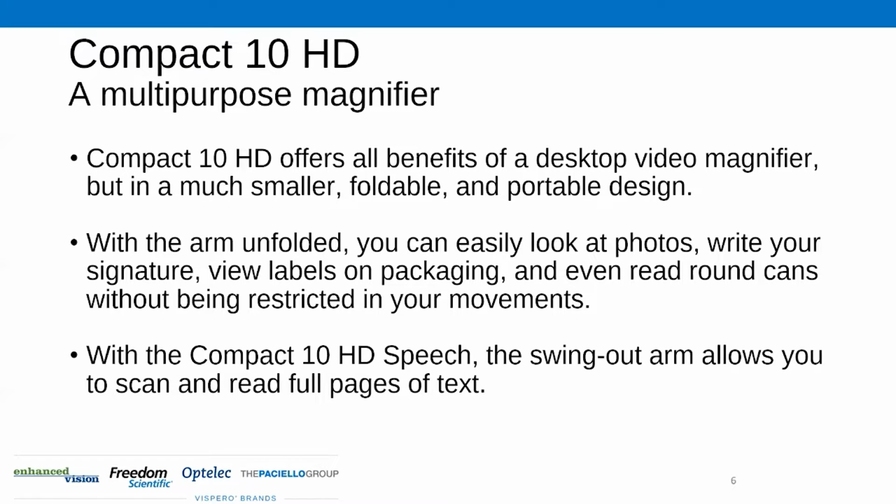And actually fitting all those requirements in the 10-inch package is quite difficult, mainly because of the form factor that these smaller devices tend to come in. It means that the camera height, particularly in reading mode, can be very restrictive, limiting the amount of information the user, the client, might be able to get on the screen.